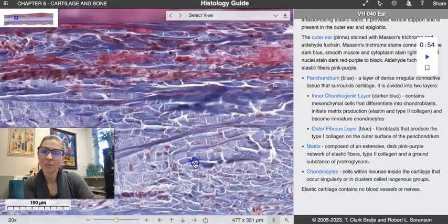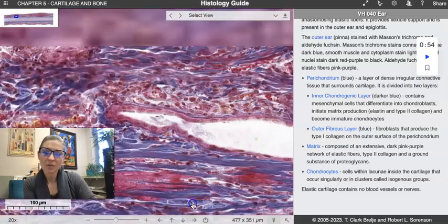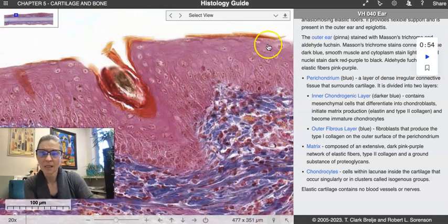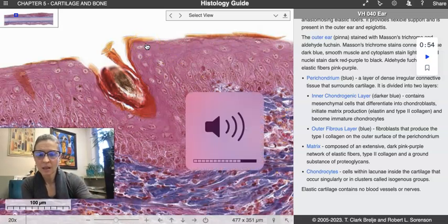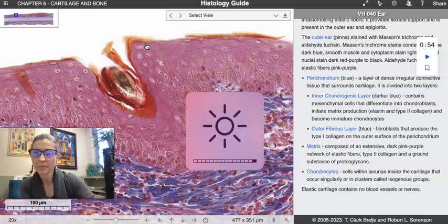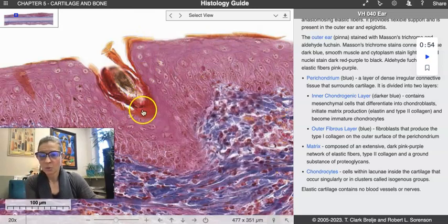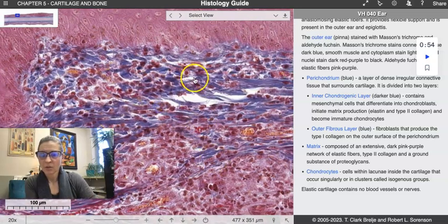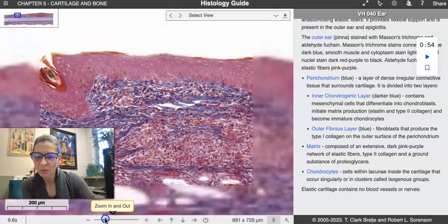Keep on scrolling down. Lots of connective tissue and blood vessels in there. And then look, right there, stratified squamous again. This would essentially be the keratinized layer of the skin. You can see the basal lamina that is here. This entire pink section is going to be our stratified squamous. Let's see, I'll brighten this up a little bit. And this is a remnant of an actual hair follicle. If you were to scroll around, you would see different layers of the dermis. You might see some glands and that kind of thing in there, typical of what we would see in skin.